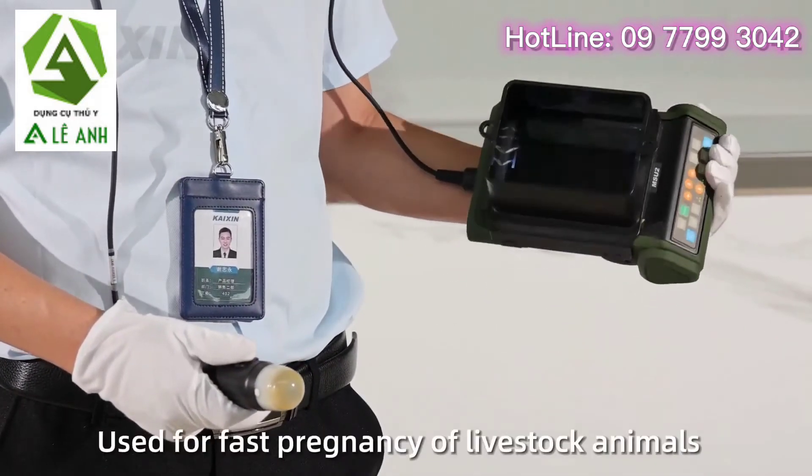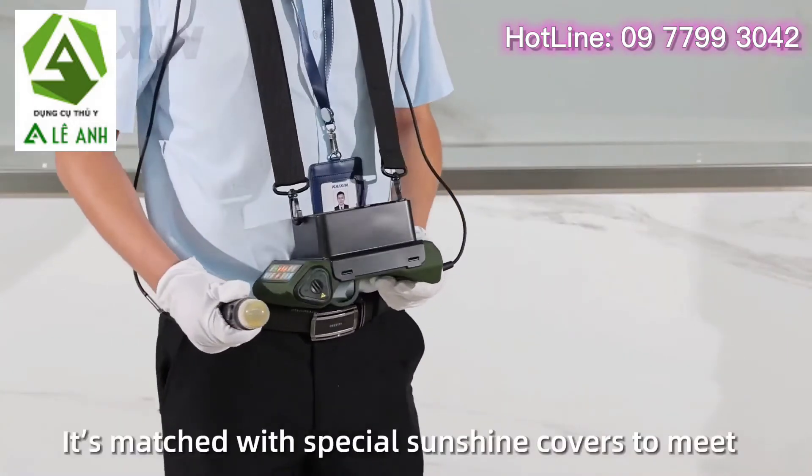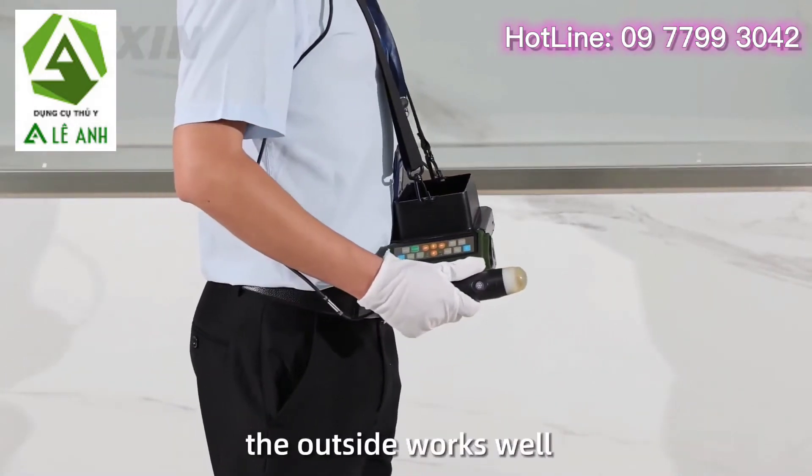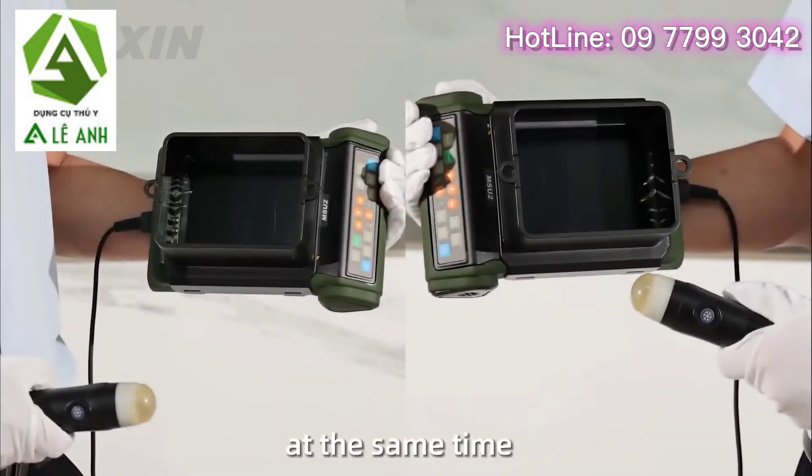Used for fast pregnancy detection of livestock animals, like sows and sheep mainly. It is matched with special sunshine covers to make outdoor work easy. Also, it meets the needs of both left and right hands at the same time.